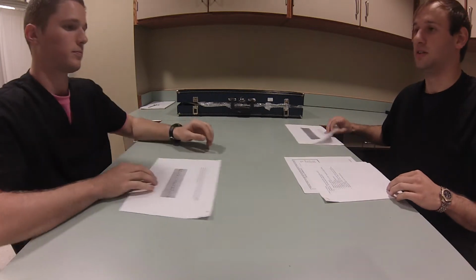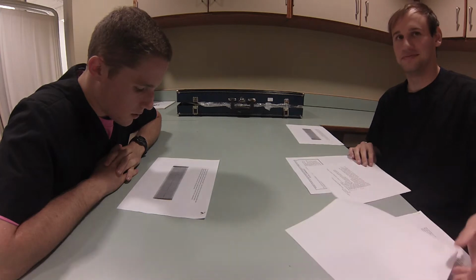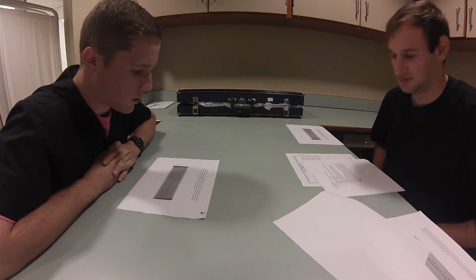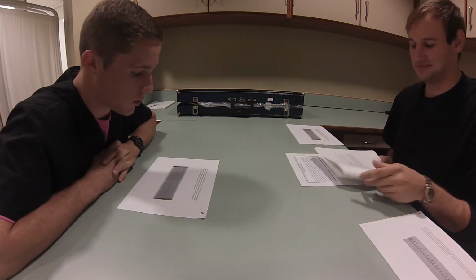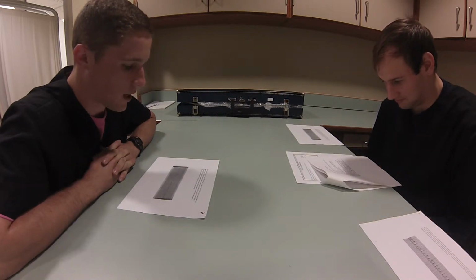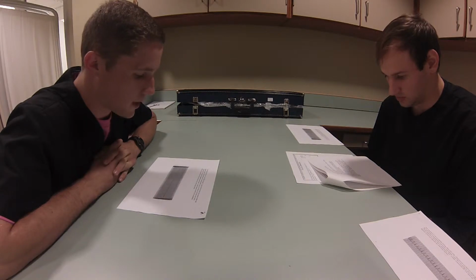All right. Case 2. Case 2 is 3rd-degree heart block. You respond to an 84-year-old sick, elderly female. Upon arrival, your patient is awake and appearing weak. She states that she has been dizzy and very weak for 2 hours and finally passed out but quickly regained consciousness. Blood pressure is 84/60. Respirations are 26 times a minute. You place the patient on the monitor and you see the following rhythm.